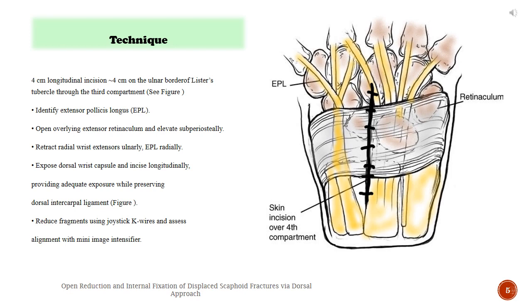Identify extensor pollicis longus (EPL). Open overlying extensor retinaculum and elevate subperiosteally. Retract radial wrist extensors ulnarly and EPL radially. Expose dorsal wrist capsule and incise longitudinally.